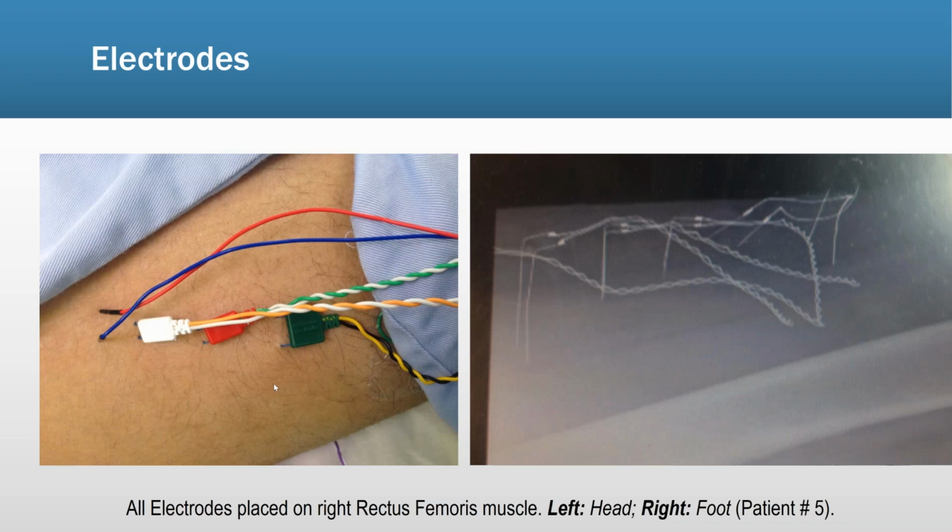Same with another patient, using the 37 millimeter, 25 millimeter, 18 millimeter, and regular 13 millimeter single needles. On the right side, I took this X-ray of this patient post-operatively, and you can see the 37 millimeter needles are reaching a much lower and more distal part compared to the other 4 needles. The subdermal needle was very superficial.